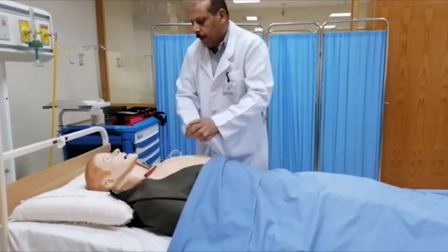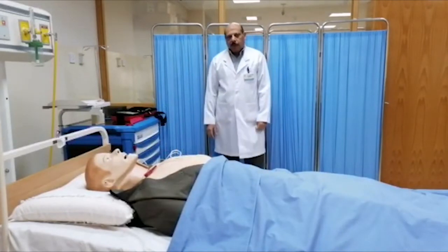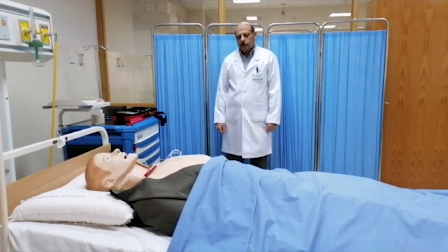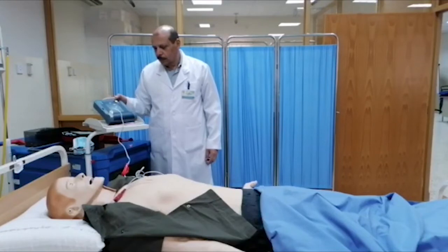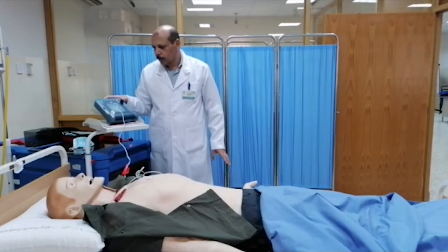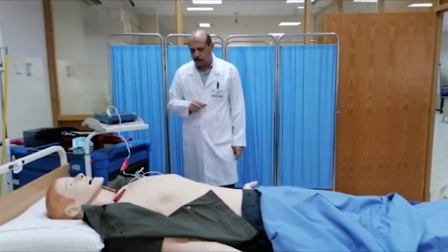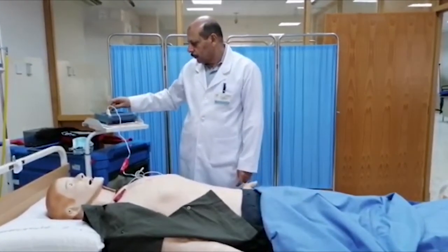Stop CPR. Stay clear. Analyzing heart rhythm. Stay clear of patient. Analyzing heart rhythm. Shock advised. Stay clear of patient. Press the flashing orange button now. Shock delivered. Be sure emergency medical services have been called. It is safe to touch the patient. Start CPR. For help with CPR, press the flashing blue button.